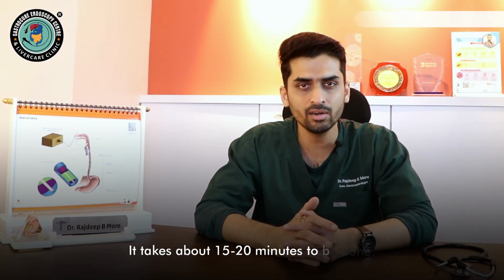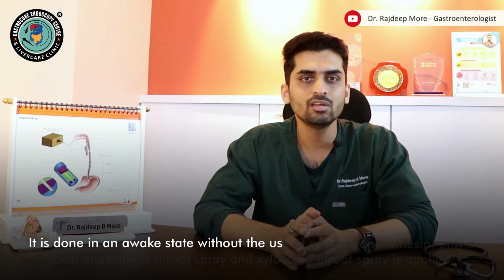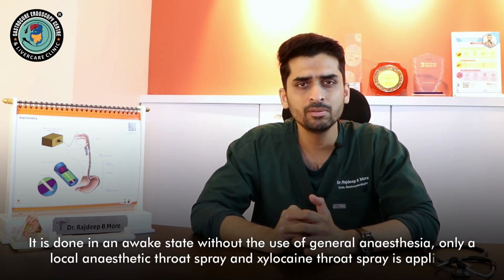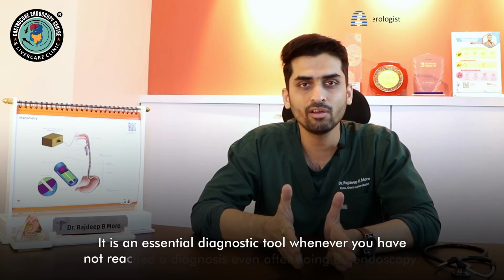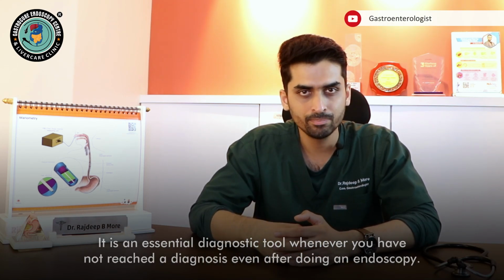The manometry classically takes about 15 to 20 minutes to be done. It has to be done in fasting. It is done in an awake state without the use of general anesthesia. Only a local anesthetic lignocaine throat spray is applied prior to the procedure. It is a very comfortable procedure and it is an essential diagnostic tool whenever you have not reached a diagnosis in spite of doing endoscopy.